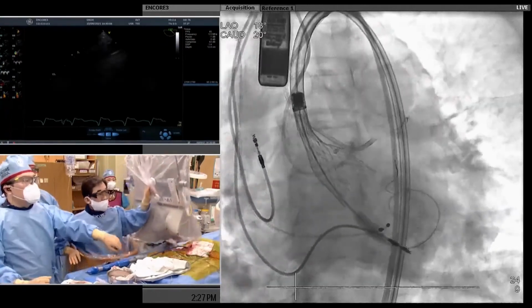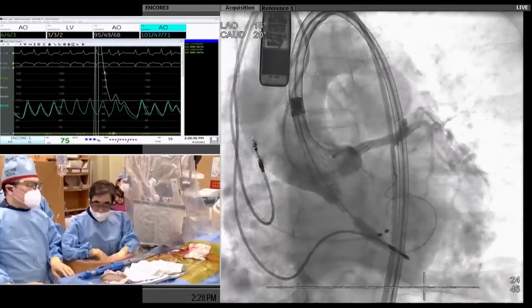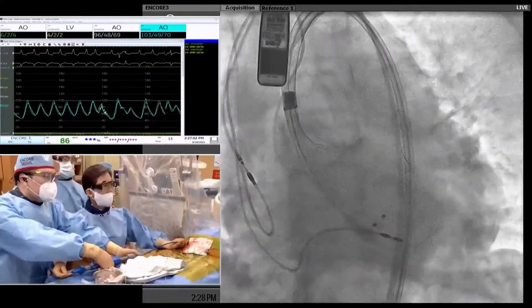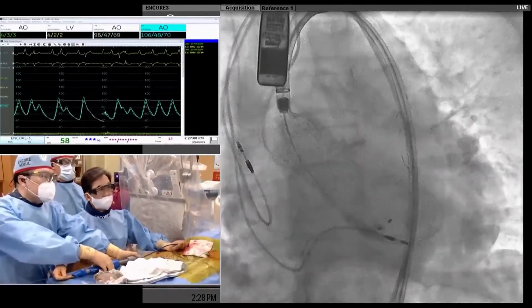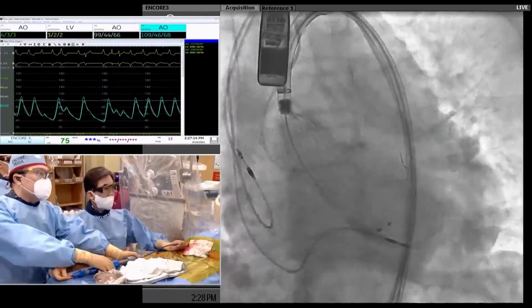Depth is good, so I start release process. Agree. Okay. We can clearly see some distance from the Evolut valve and the guiding catheter. 천천히 left side. 아, 참. 좀 기다렸다가 하고 해야지. 아무리 in depth라고 하더라도.